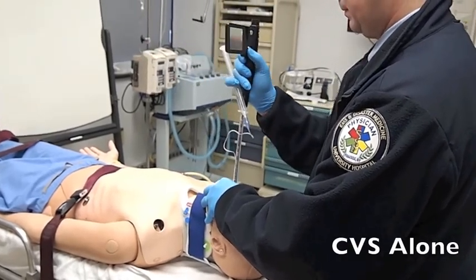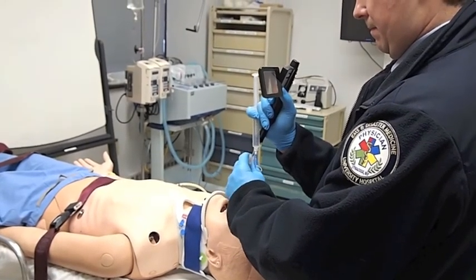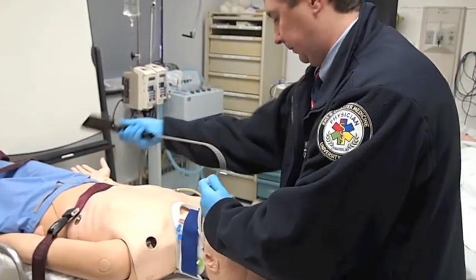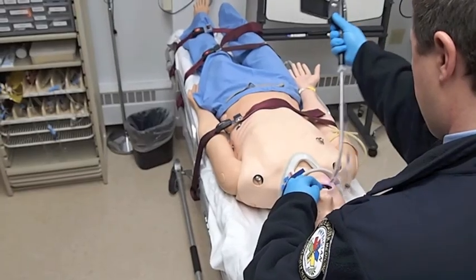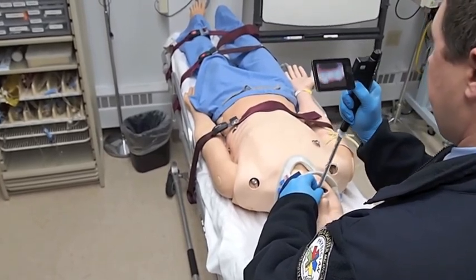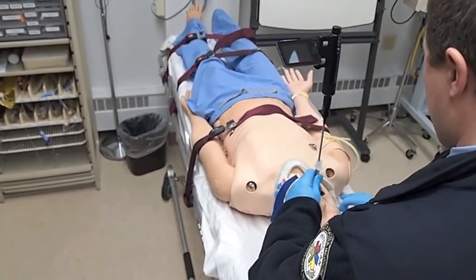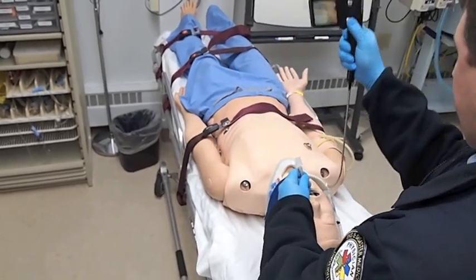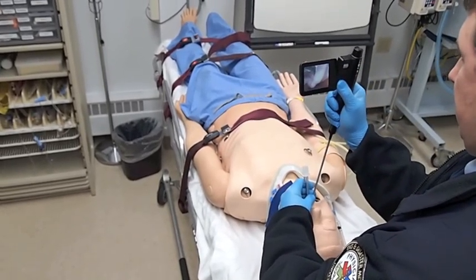Go midline, follow the airway, visualize the cords, pass through the cords, slide the tube into the trachea, inflate the balloon, and lay the instrument down. Then re-enter the mouth and check position. Once again, go midline, follow the airway, under the epiglottis, there's the arytenoids, through the cords, pass the endotracheal tube into the trachea, inflate the balloon, and lay the device flat to remove. Re-enter the mouth and confirm successful intubation. Then secure the tube.